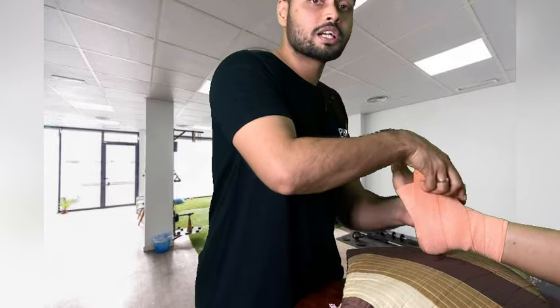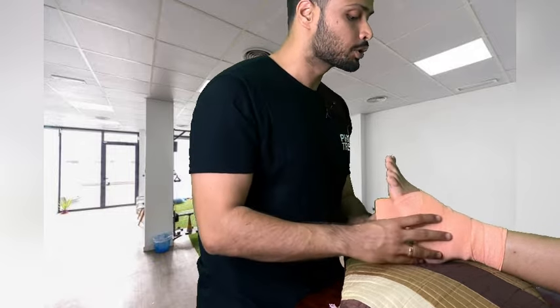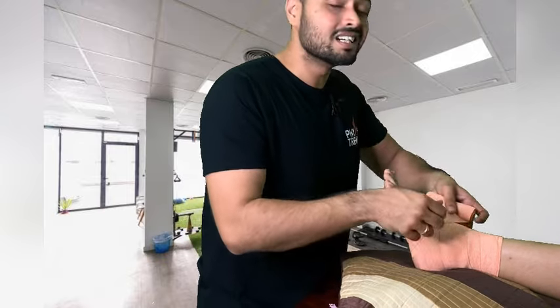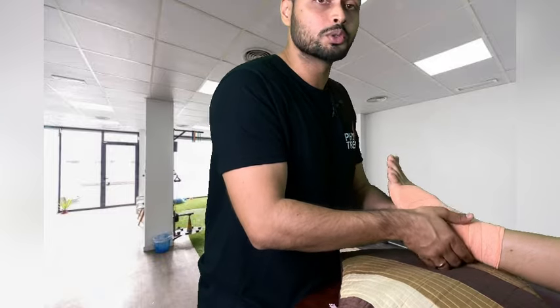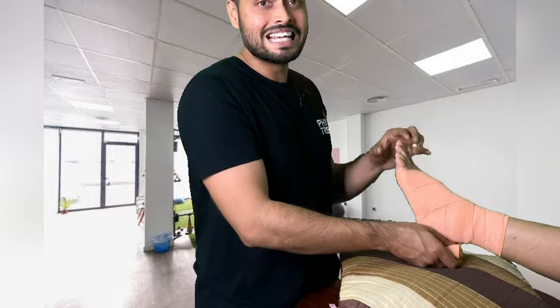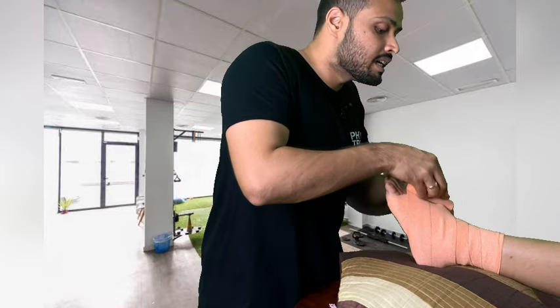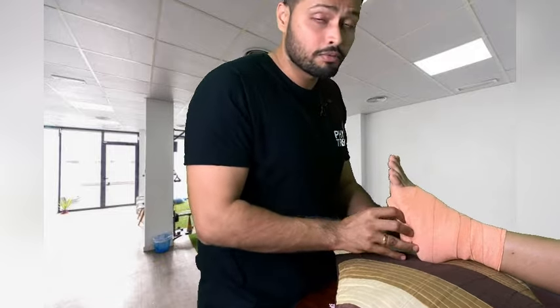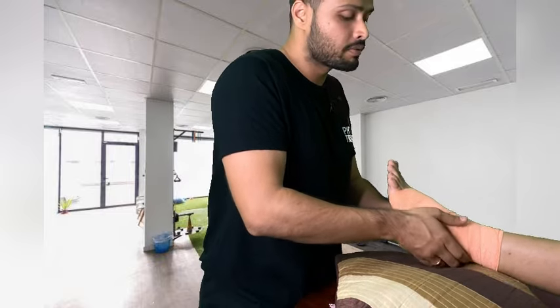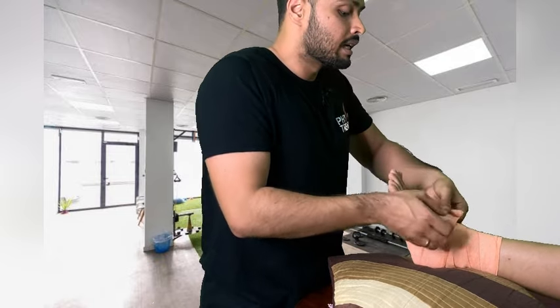Make sure that you are not doing it too tight. If the patient complains of pain due to tightness, remove the Crepe Bandage and ensure that on the anchor side it is a little loose, because drainage must be able to go in the upward direction — we cannot remove drainage from the toes. Make sure you are tying it from the half of the width so that the red line is not visible. That is the main purpose of the red line on the Crepe Bandage — so you know you are covering exactly half of it.